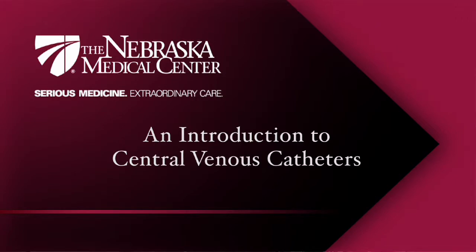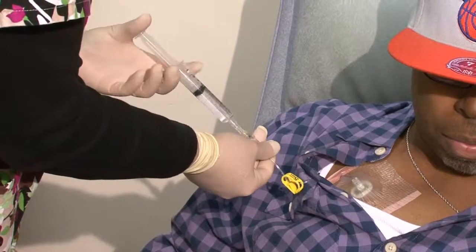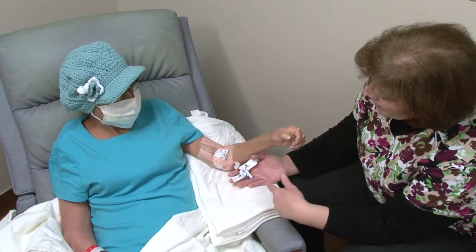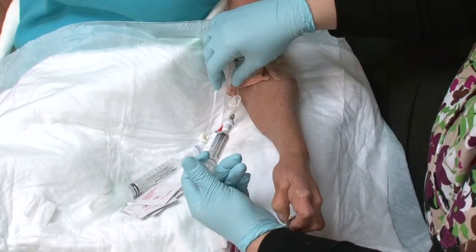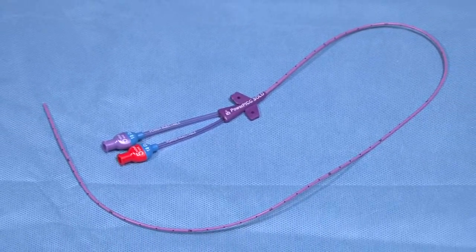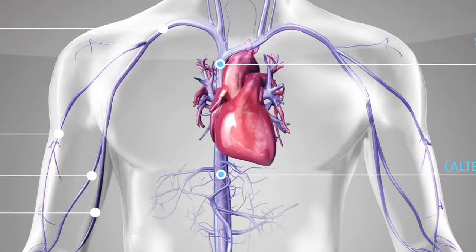Central venous catheters are used when short or long-term intravascular or IV access is needed in your care. The amount of time the catheter remains in place varies depending on the needs of each patient. Some people will need their central line for a few days, while others may need it for several weeks, months, or even longer. The catheter is a long, soft, thin, hollow tube placed into one of the large veins that lead to your heart. Those large veins are part of your central blood circulation system, so we call these catheters central line catheters or central lines.